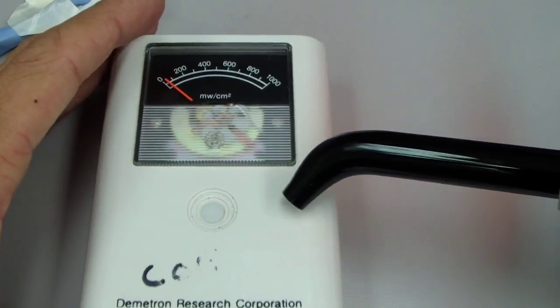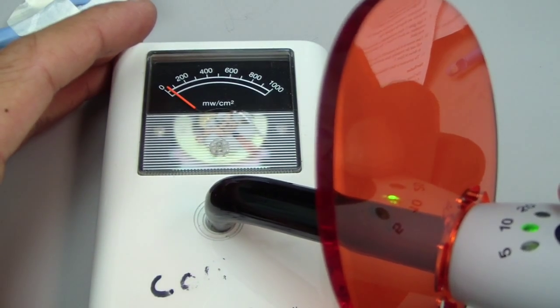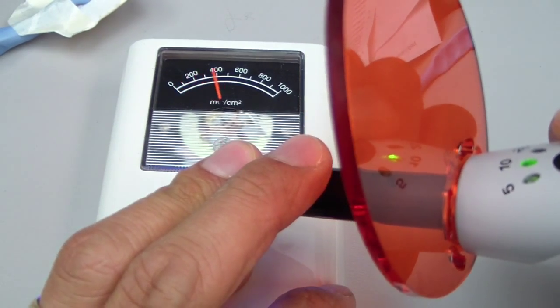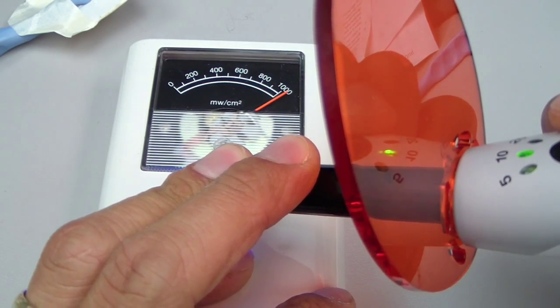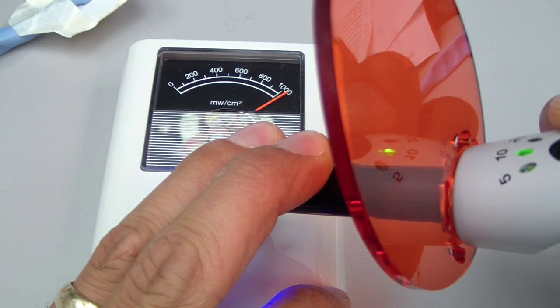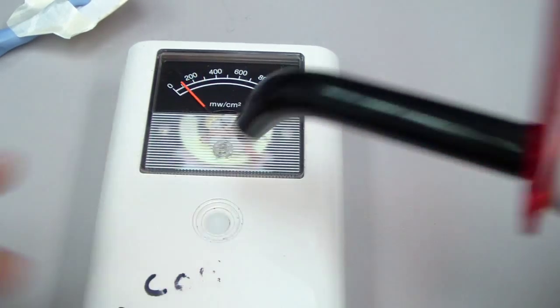We're going to do a control check in this little experiment. We've set the light table on the radiometer, and from previous experiments I know this is around 1200 mW/cm² — and it's going to start pulsing. So above 1000.